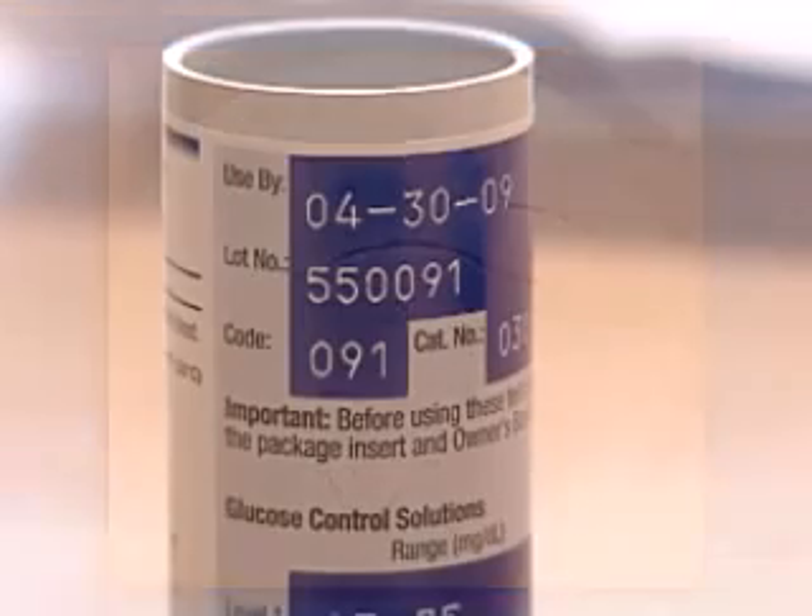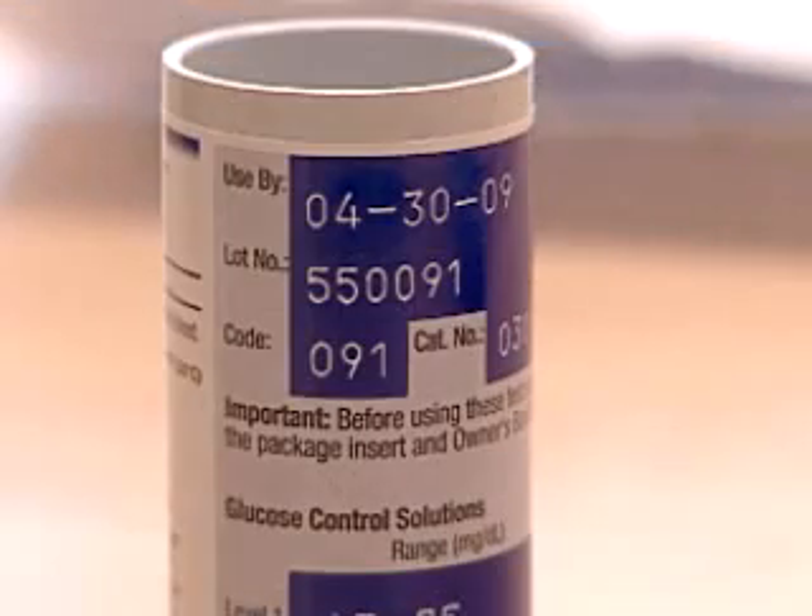Even if an incorrect test strip fits in your meter, it could give you the wrong results. Don't use test strips from a cracked or damaged bottle, and don't use test strips that have passed their expiration date.